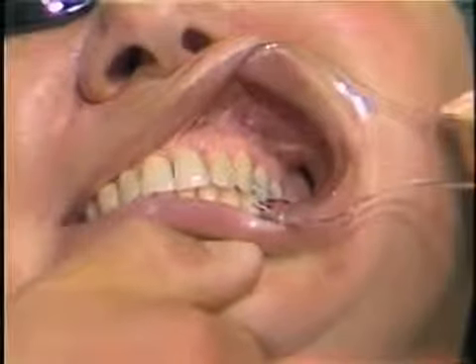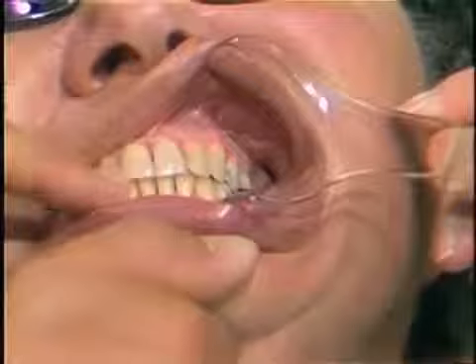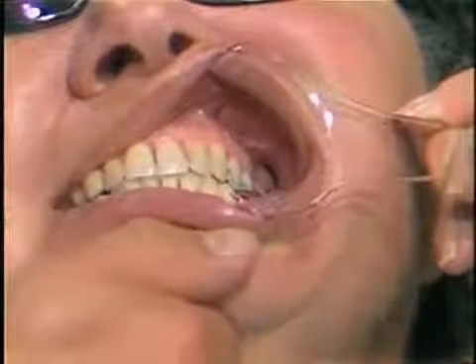Now move your jaw toward me. That's good. Now bite down and move your jaw toward me again. That would be recording the balancing position. Okay, now bite down and move your jaw away from me. That's it. Just let your teeth glide over each other. That's it. Very good. Bite down again in the center, and slide your jaw straight forward, registering the protrusive excursion.